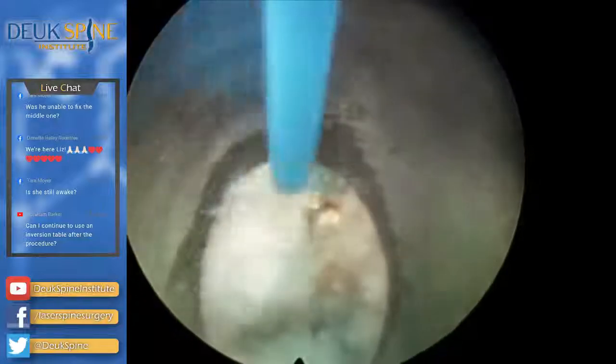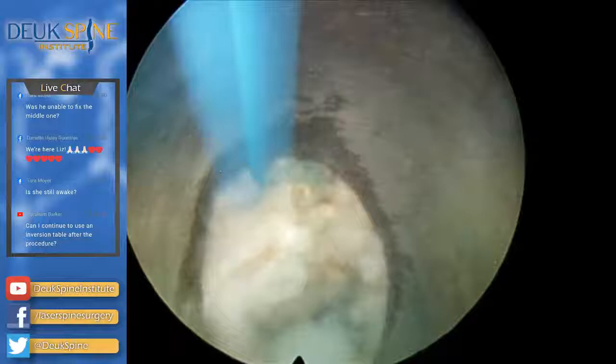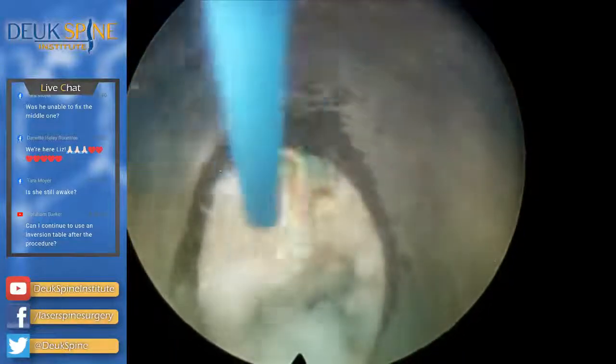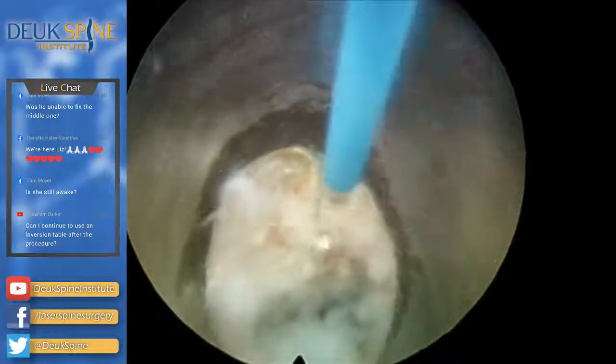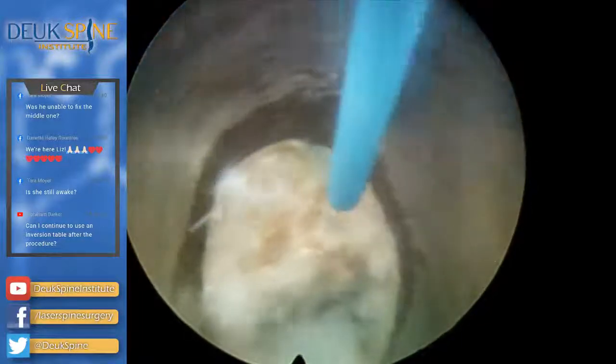And the blue stuff is a herniation inside the tear. You can see there's not a lot of herniation inside the tear. It's just a thin streak of blue. So there's a thin amount of herniation. This would be a skinny herniation, basically, or a very thin herniation.